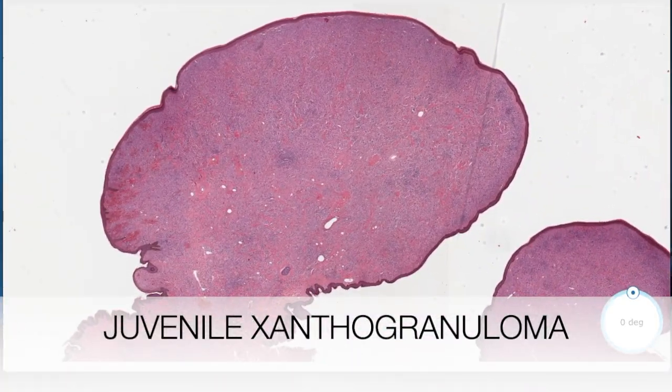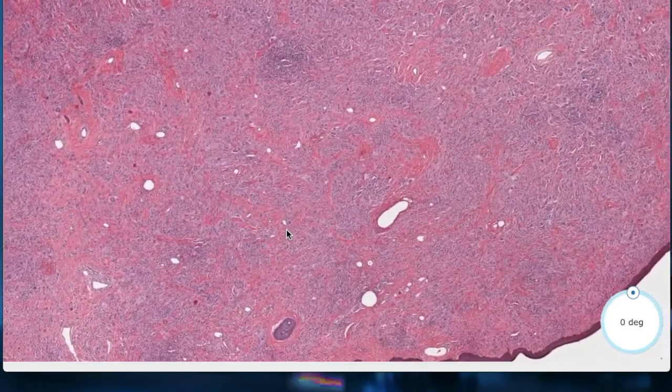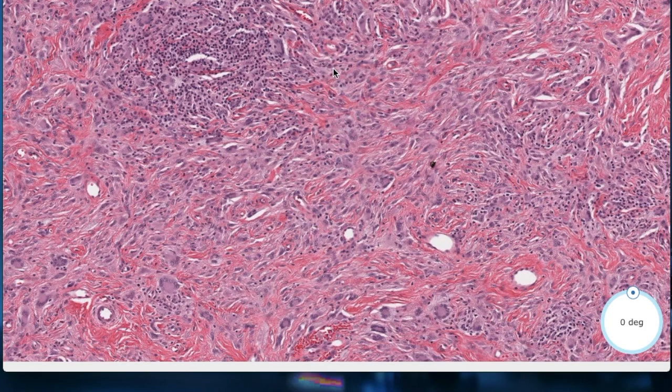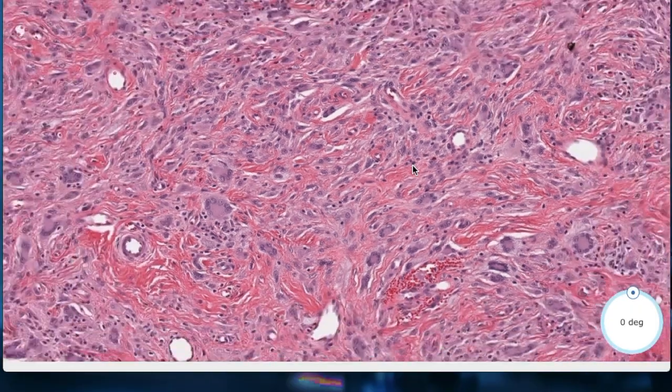So they are forming granuloma in the dermal area with foamy histiocytes like these pale pinkish cells, and we have here giant cell formation, little bit of lymphocytes, and we have the degenerated collagen. You have more giant cells and all these foamy histiocytes, xanthogranulomas.